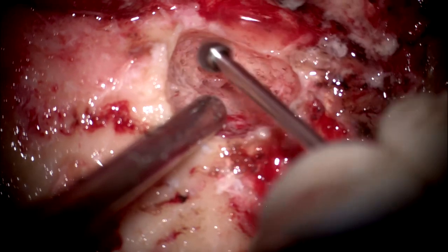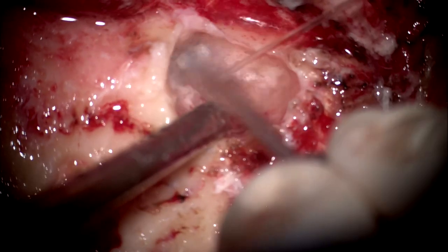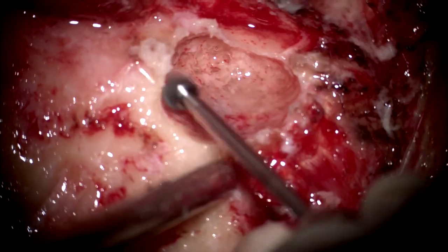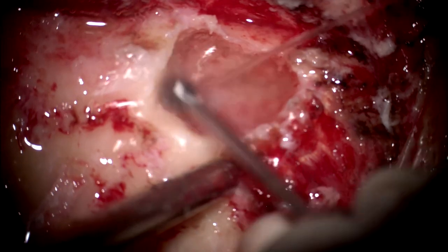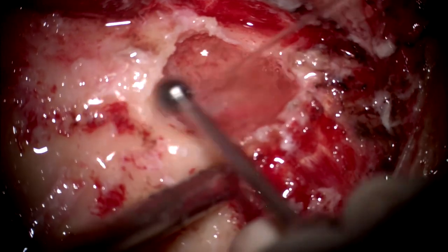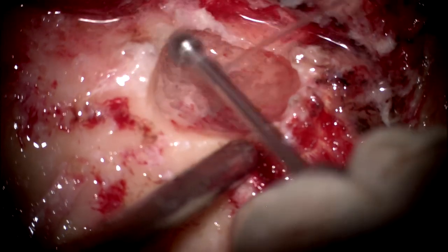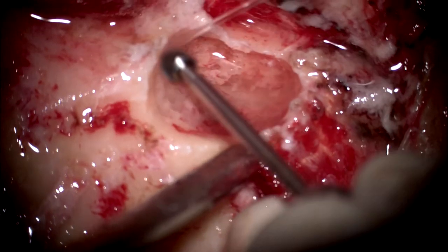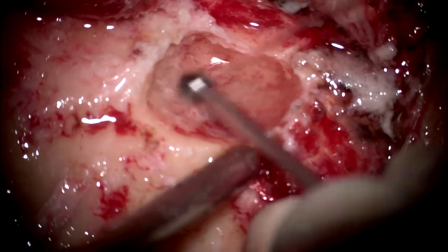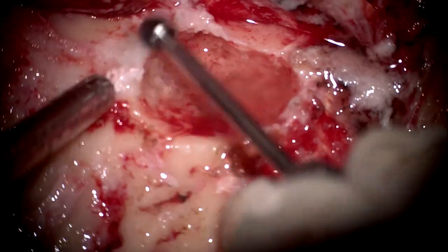And a classical cortical mastoidectomy is required to flush all around. To flush the middle fossa plate, to flush the sigmoid sinus. Anteriorly, thin out the canal wall and find the vertical course of the facial nerve. And inferiorly, the jugular bulb. And exenterate all cellularity and the entire bone in between these spaces, including the part of the labyrinth, the semicircular canal and the vestibule. That will take you to the internal auditory meatus. So, just to orient you, see the cortical mastoidectomy being done so nicely by him.